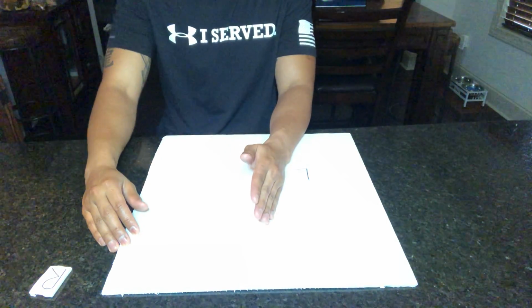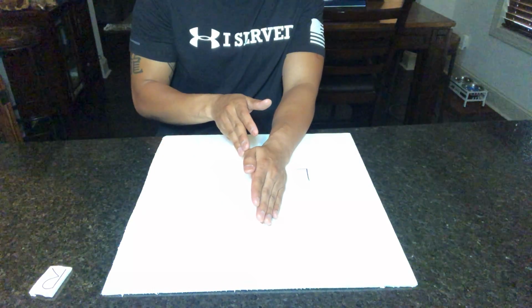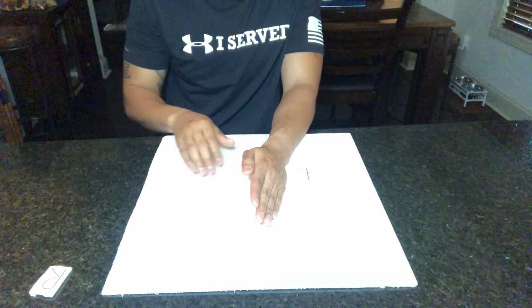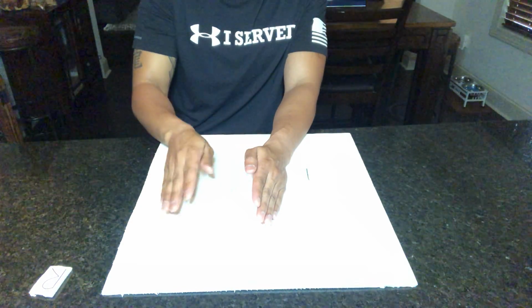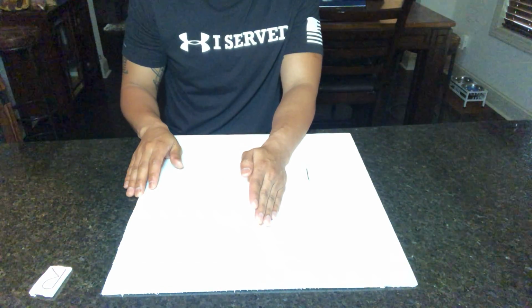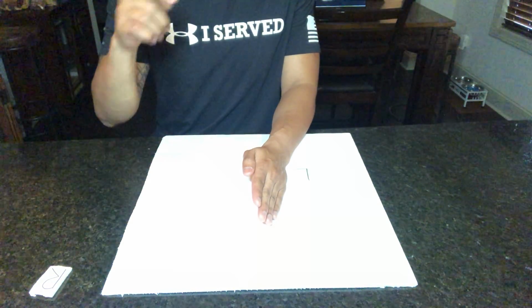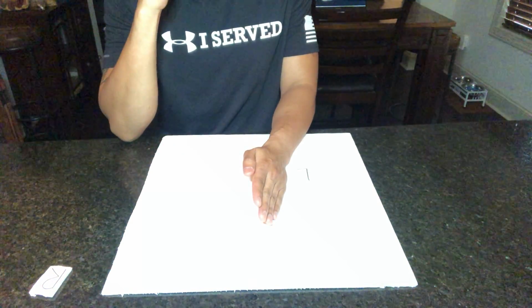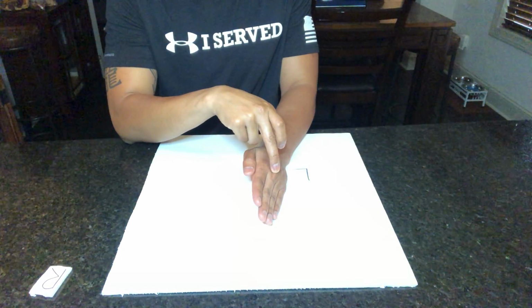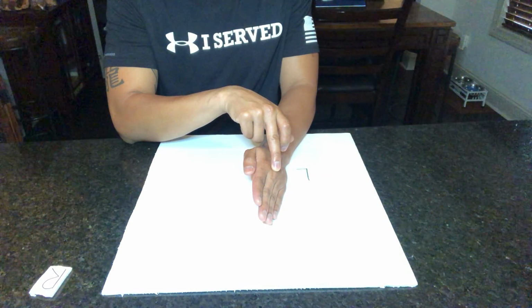Have the patient rotate their hand to an angle on the knife edge here, ulnar side. We may have a sponge or a pillow here for them to rest their hand upon. And with the oblique hand, 40 SID, again on a 10 by 12 cassette, the central ray is going to be perpendicular again to the third metacarpophalangeal joint, again centered to the film.